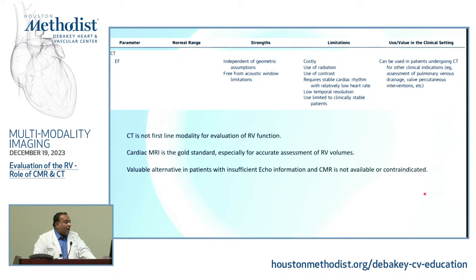In this paper, they go over the strengths and limitations of the different modalities for evaluation of right ventricular function. Here's the column for the CT. Of course, the strength is that unlike echo, it's independent of geometric assumptions and free from acoustic window limitations. You acquire a 3D data set. You can manipulate it whichever way you want.